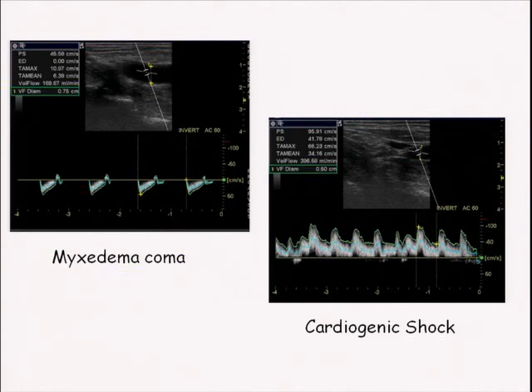So just to finish, these were 2 patients who were in the ICU this week. This on the left is a patient with myxedema coma, who had a TSH of 210. What was fascinating, we did Doppler studies, and you can see that minuscule blood flow with a complete absence of diastolic flow. So this patient obviously was hypometabolic. The patient's temperature was 32 degrees. The patient's brain obviously didn't require as much oxygen, so the brain was able to regulate its blood flow.